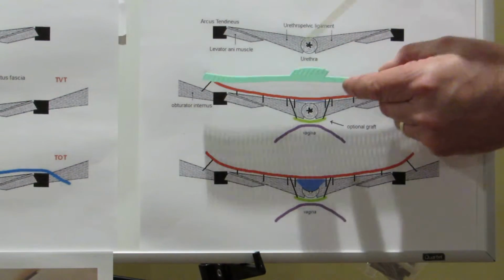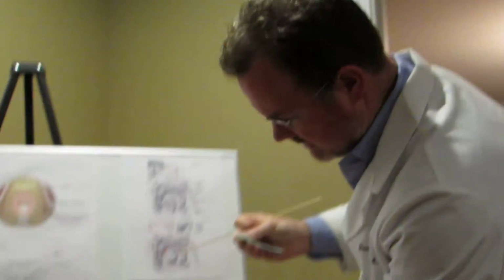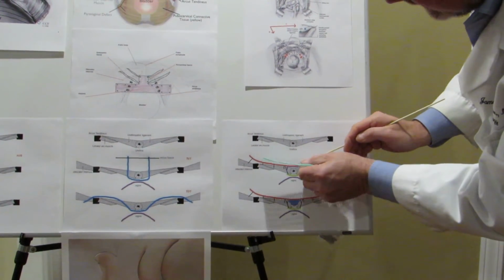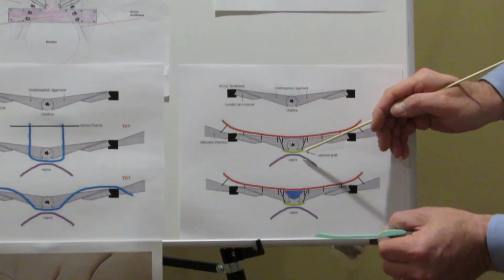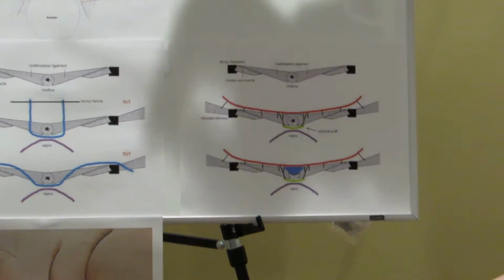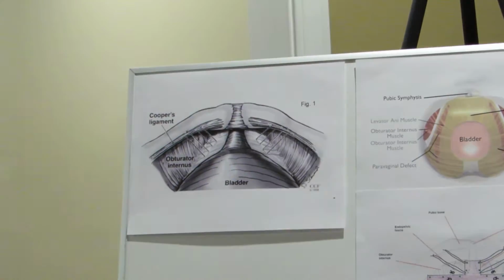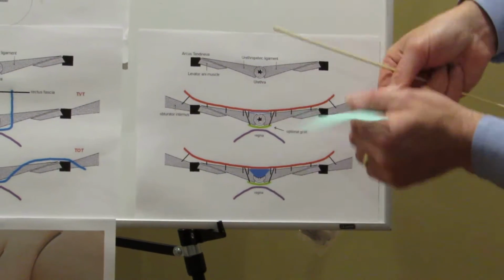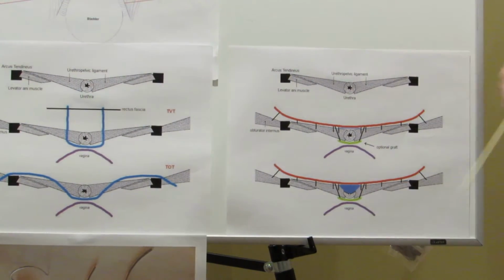You have the option of placing an optional graft underneath here that is about the size of this element here, that basically can be placed through the vagina if wished, in order to place sutures through the implant all the way down to a piece of donor tissue or some sort of bioabsorbable material here and here. And it basically would be on the opposite side of this area, on the vaginal side, underneath the urethra, in order to create a clamshell space, I call it. Create a confined space, so that make it even more likely for an expandable member here to occlude the urethra as it expands.